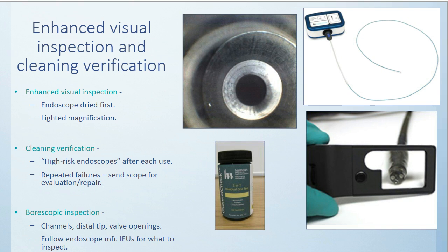So we consider the use of cleaning monitors that are also known as cleaning verification tests. Reinforced is sending scopes for repair that repeatedly fail cleaning verification tests or have damage. Directions given to use of cleaning verification testing, as we mentioned, for all high-risk endoscopes.